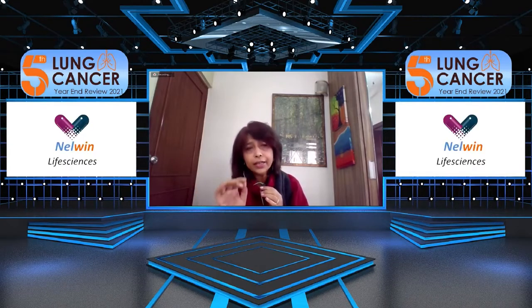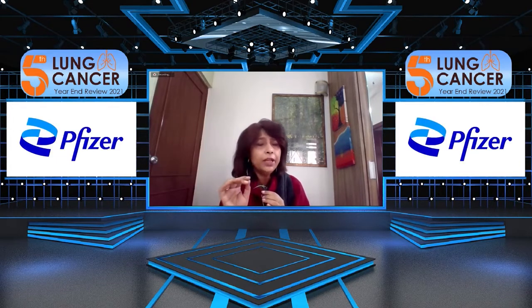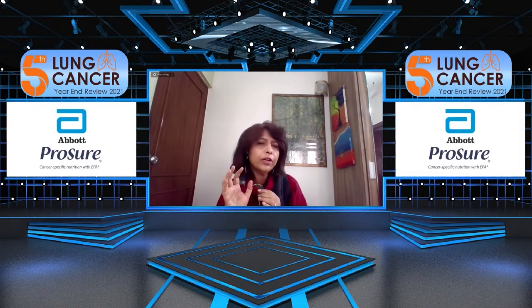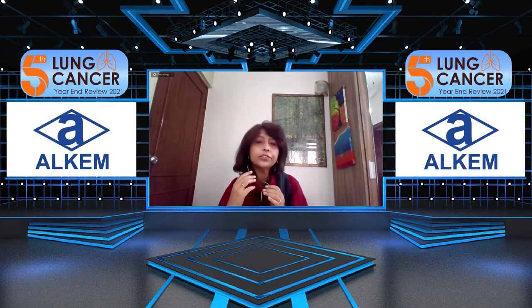So to just reiterate again that in an Indian setting, you may not be reporting a lot of these things under the LCS programs and they may be incidentally detected nodules, then the course of action may be different because, if you are strictly doing it under the lung cancer screening program, you can stick to the Lung-RADS descriptors.